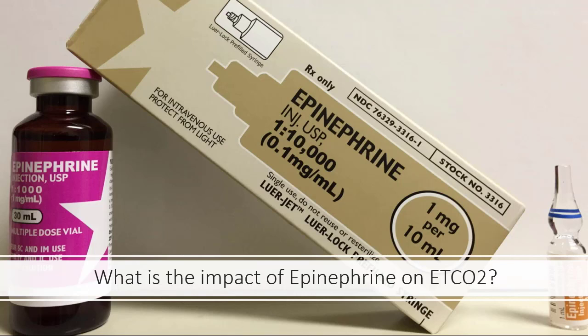So what is the impact on end-tidal CO2 and epinephrine? We already alluded to this. From a study in 1990 in the Annals of Emergency Medicine, Dr. G.B. Martin and company found that there was a significant increase in coronary perfusion pressure after epinephrine, but this resulted in a decrease in end-tidal CO2. This occurred with both epinephrine and norepinephrine.